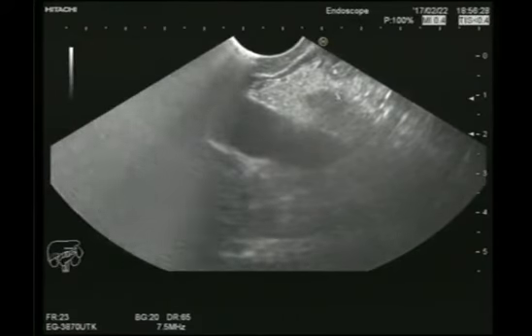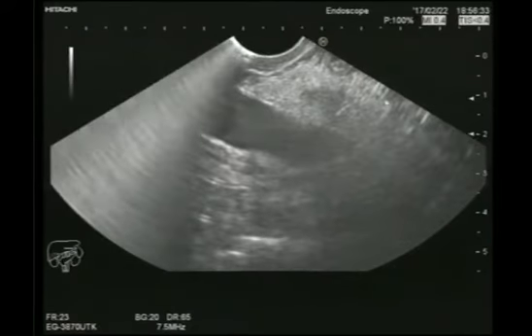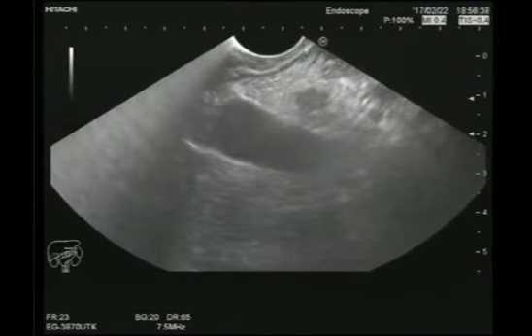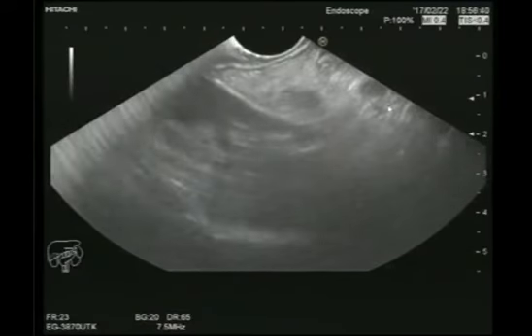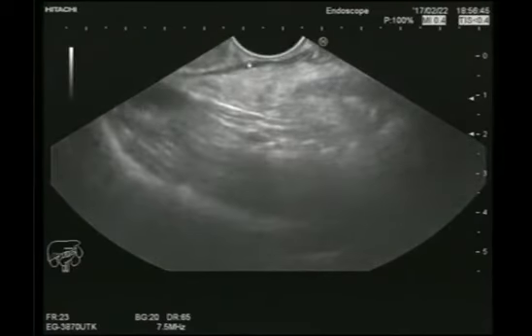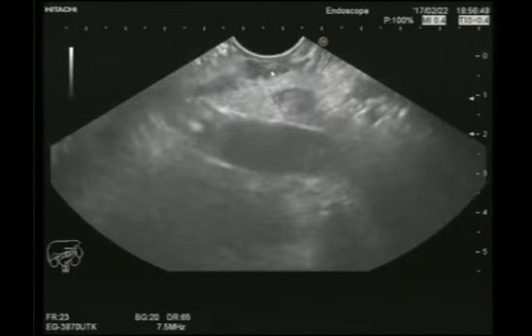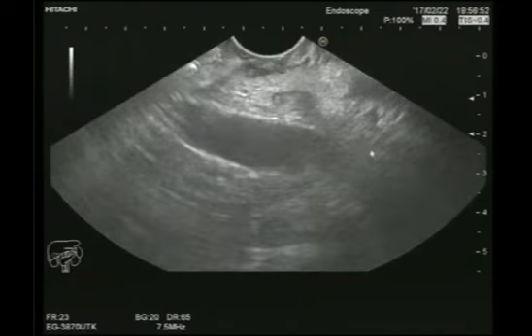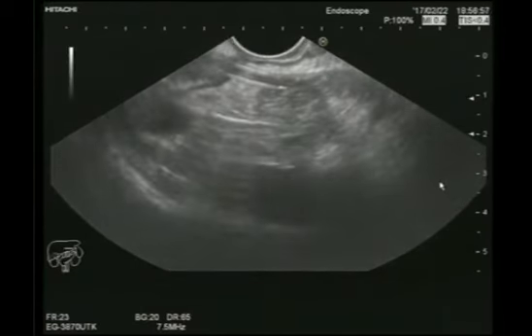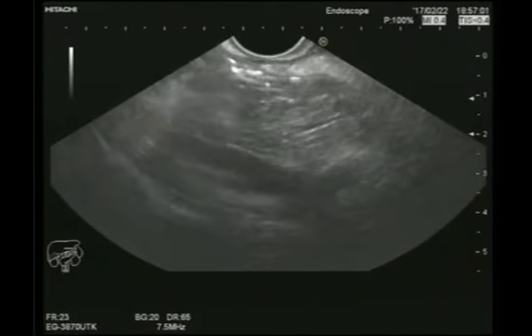Yes, now the head of the pancreas is in full view, and at the extreme right you will see the appearance of the papilla. This is the muscularis propria, yes, the muscularis propria, and adjacent to the muscularis propria we are examining the papillary region very slowly, very slowly. Yes, now we see the stent which has been put previously.